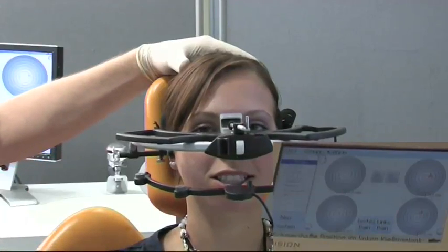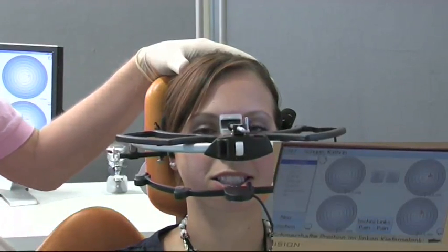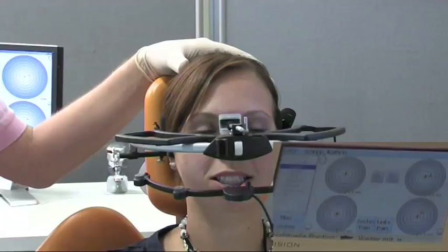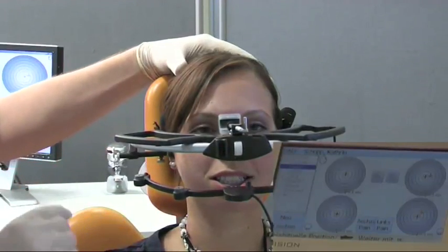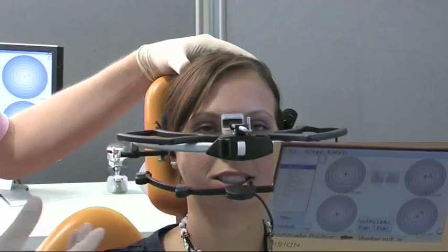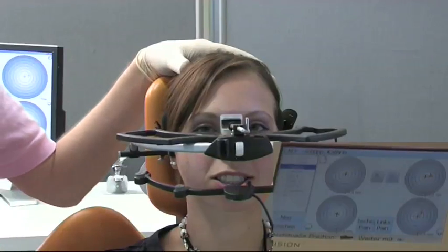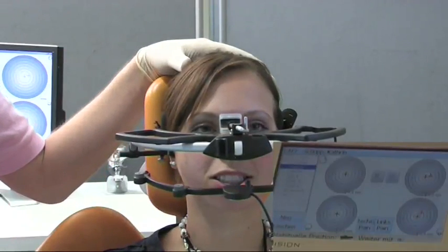We can do the same for the other side. But we don't need to do that, we can skip that here, because there was nothing. Now bite down as you would normally do, just as your bite is. Hold it there. Do not move.